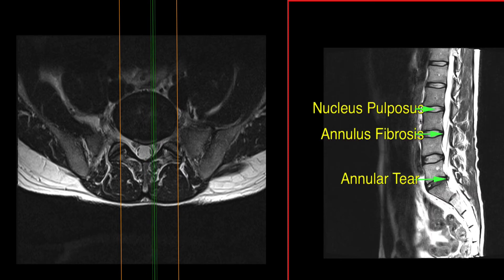I'm going to click over one more image where I've labeled the nucleus pulposus, which is the center of the disc. The back and the front of the disc has a strong, thick ligament called the annulus fibrosus. And then down here at the L5S1 level, there's a bulge to this disc and an annular tear in the posterior aspect of the disc.